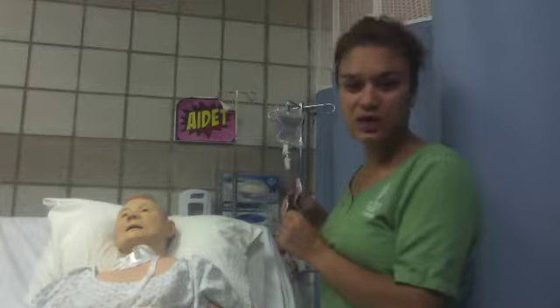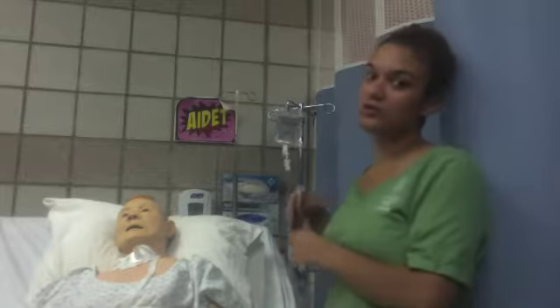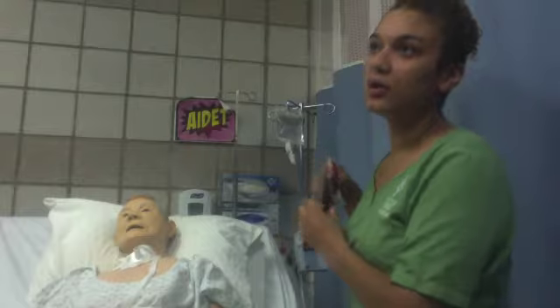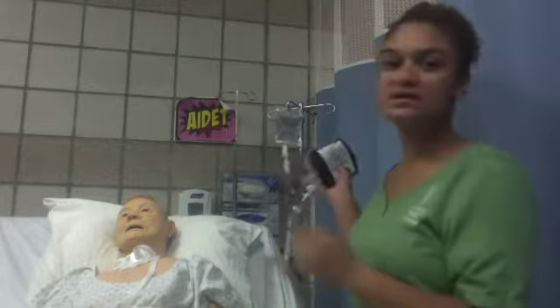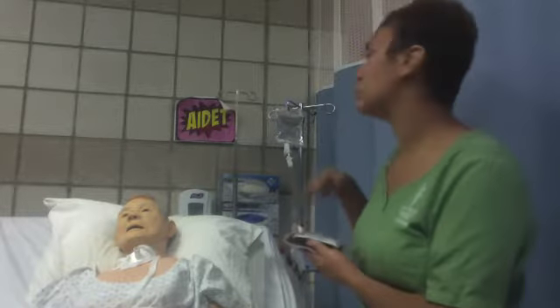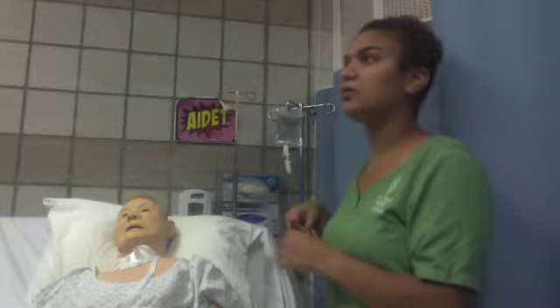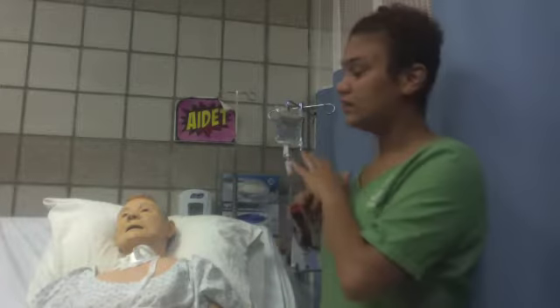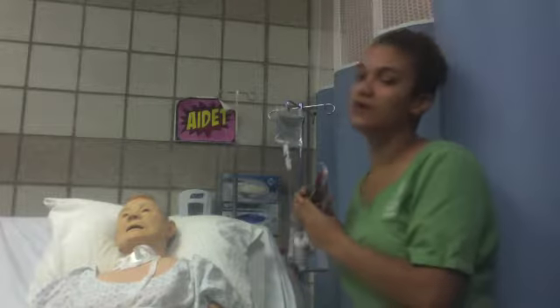If we are having any issues such as fever, rash, chills, any allergic reactions, any reactions period that are not consistent with what we need, we're going to go ahead and call the PCP, the primary care physician, and we're also going to call the blood bank. And then we would stop the transfusion immediately. We would tear it all down, put it in a proper waste receptacle so that the blood bank can verify the reasoning for the reaction. The primary care physician can verify if it's the blood or if it's the patient or what we need to do next and provide orders for that.